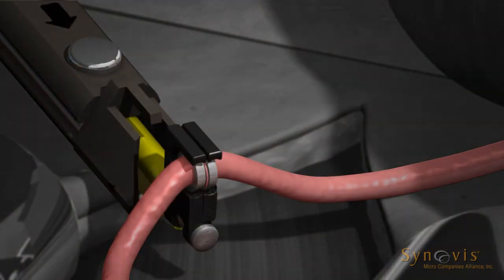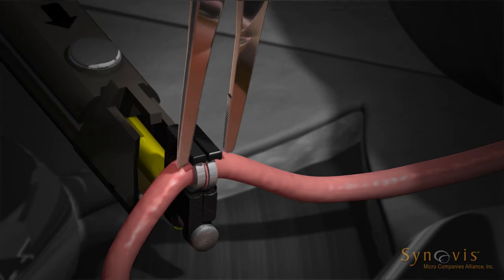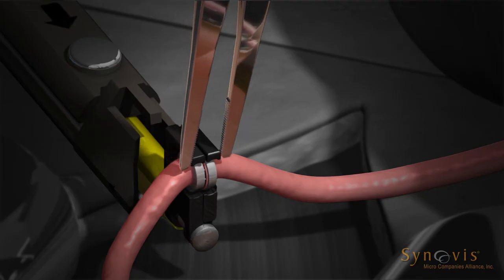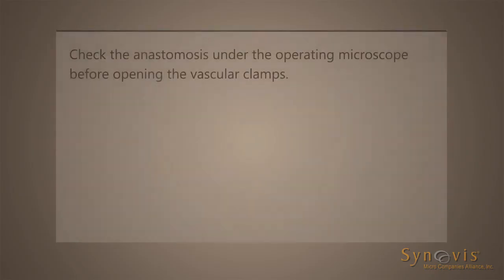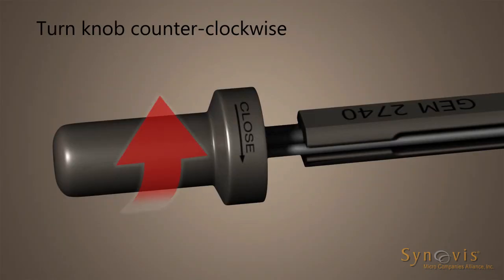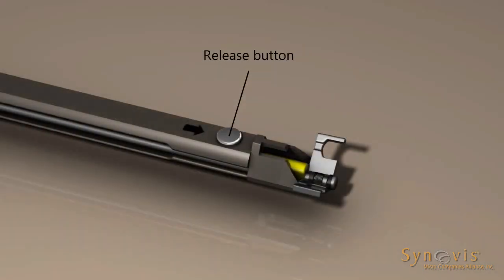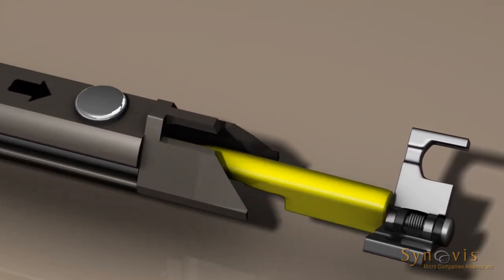Bring the rings together by turning the anastomotic instrument knob clockwise. Before ejecting the joined rings, gently squeeze the end of the opposed jaws with a small hemostat to ensure ring approximation and a tight friction fit. Turn the anastomotic instrument knob further clockwise to eject the joined rings. Check the anastomosis under the operating microscope before opening the vascular clamps. To remove the jaw assembly, turn the anastomotic instrument knob fully counterclockwise. Press the release button located near the arrow on the anastomotic instrument and remove the jaw assembly.